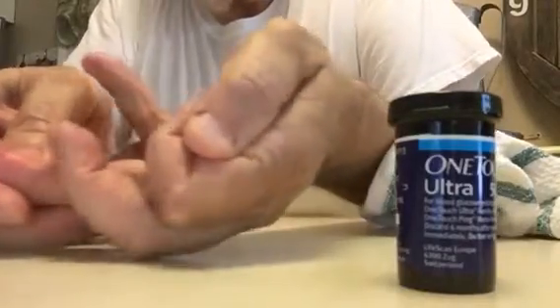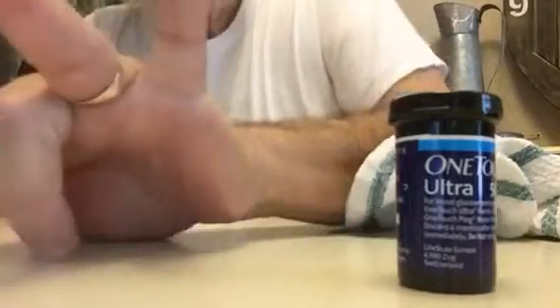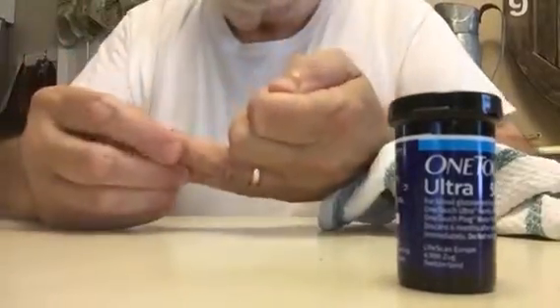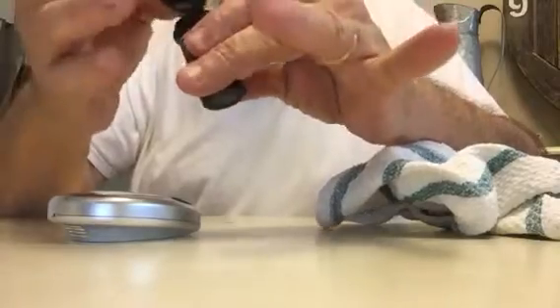I'm going to press it just a bit and you'll start to see blood coming up — you couldn't even feel a thing. There's the blood. Now at this point I go ahead quickly — you don't want to leave the cap open, these test strips are very sensitive.